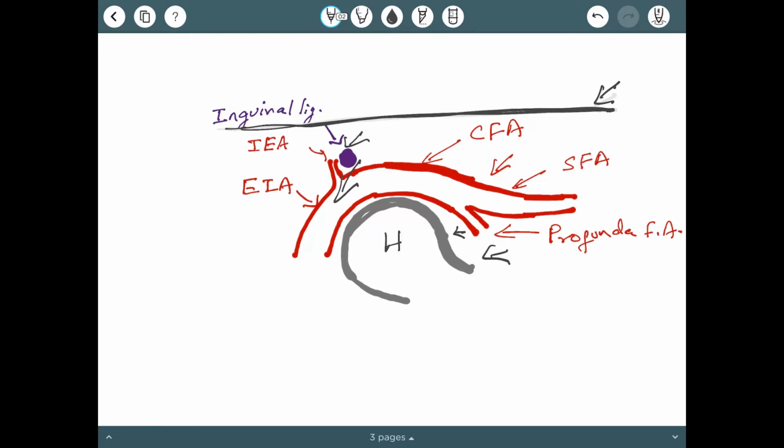So when you are puncturing very high, and you want to seal this rent and apply pressure on the surface, there is nothing at the back. It's just a hollowness there. So you are not going to have any counter pressure to seal that puncture site. Additionally, there are branches like the inferior epigastric artery.